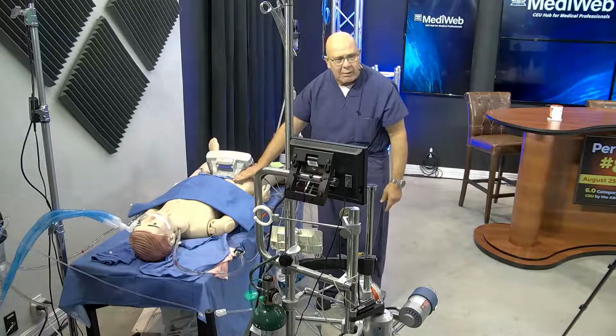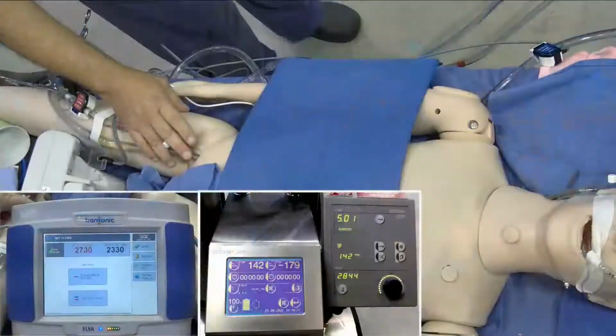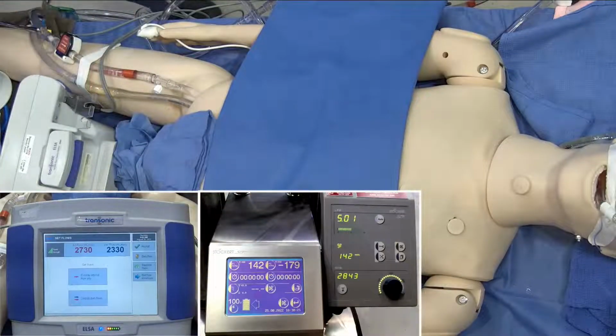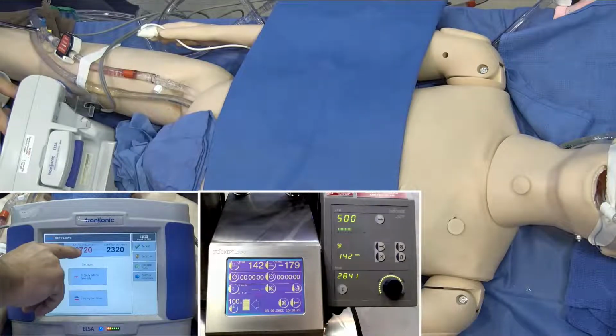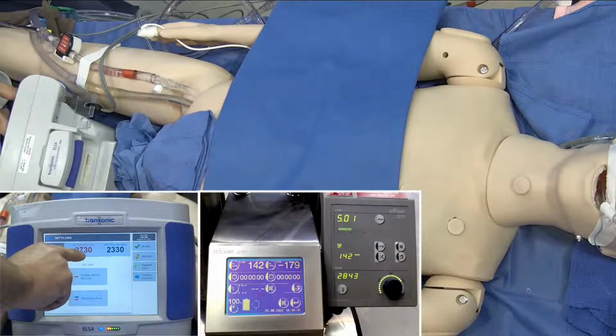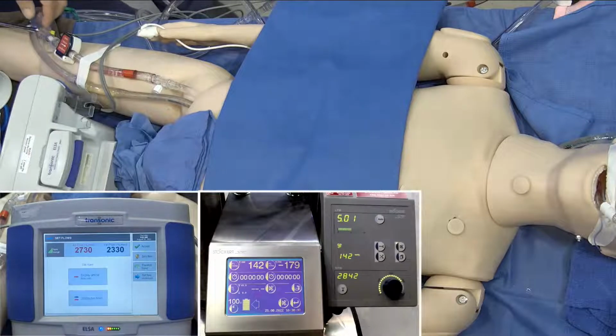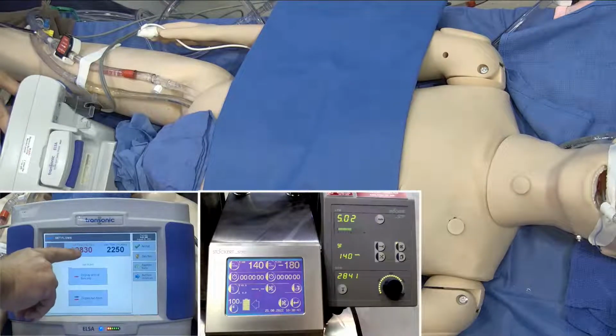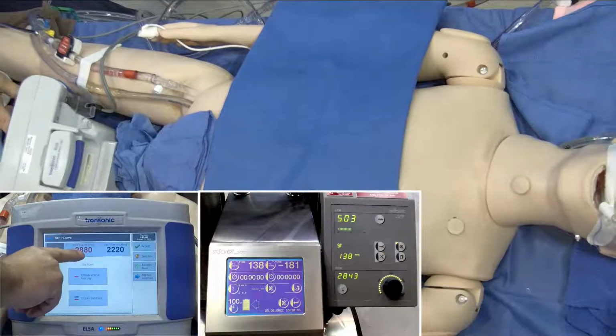So I want to see how I affected the flows. So now our total flow is 5. Our flow arterially is 2.7, and it's 2.3. So we're going to certainly improve oxygenation tremendously, but our flow did get compromised a little bit. So I'm going to reduce this clamp, and this is why it is so easy. I want to at least get to 3 liters on my flow here.